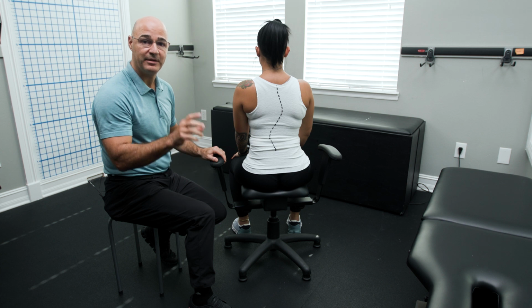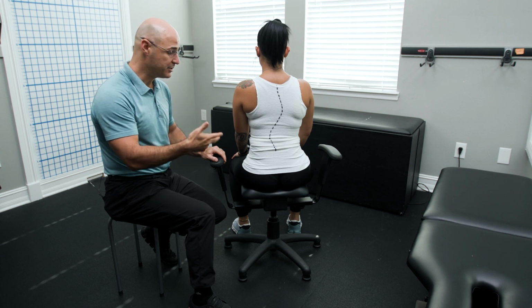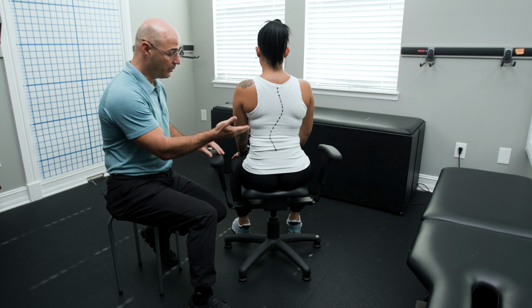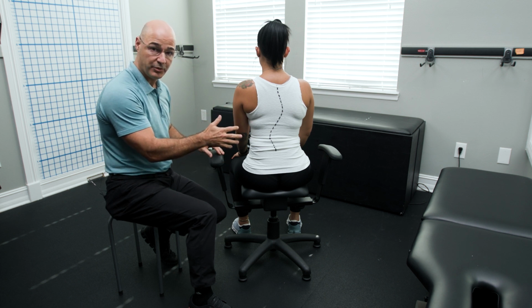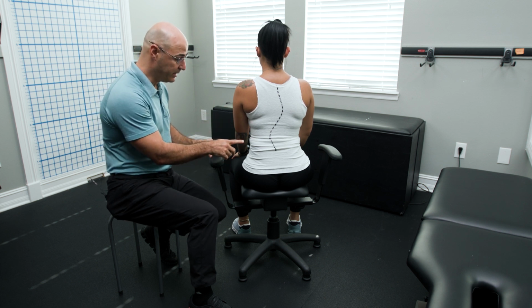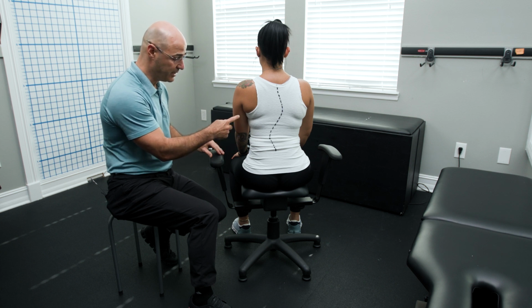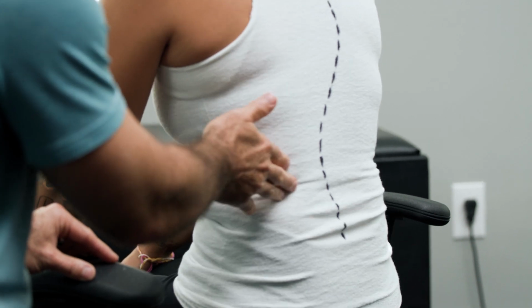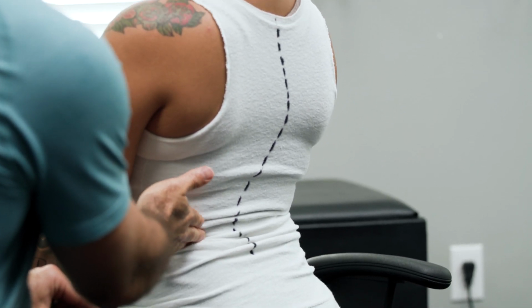Before we demonstrate the curve patterns, we want to demonstrate what the Wobble Chair can be used for: general flexibility and spinal health. So first thing is we have 3 basic motions that we teach. One is called flexion extension. So this is where the patient goes through this type of motion, go ahead and extend and flex. So you can see how she goes through full extension and then full flexion.